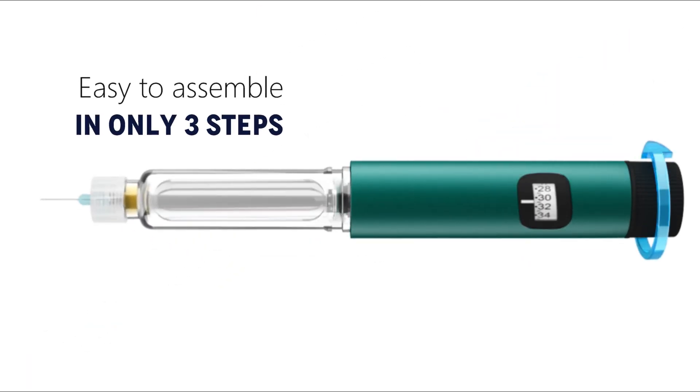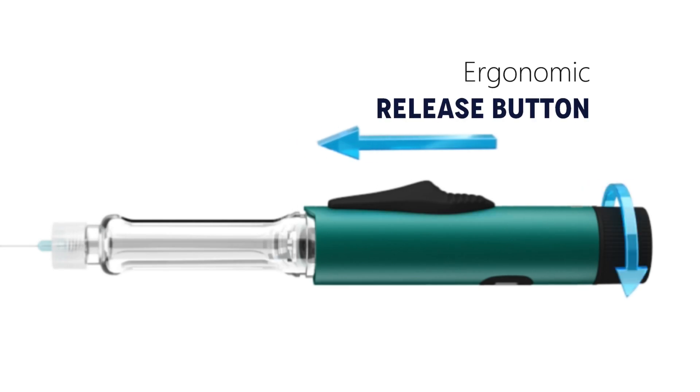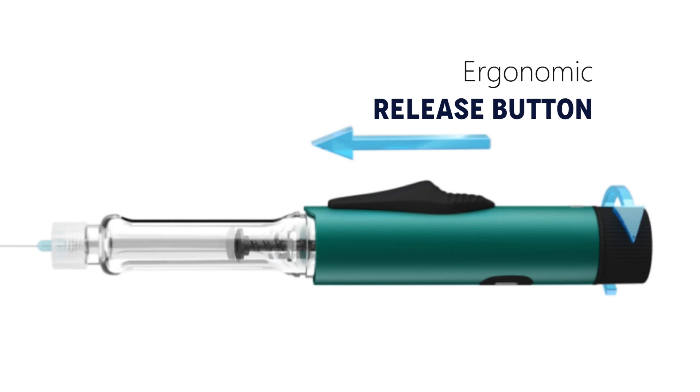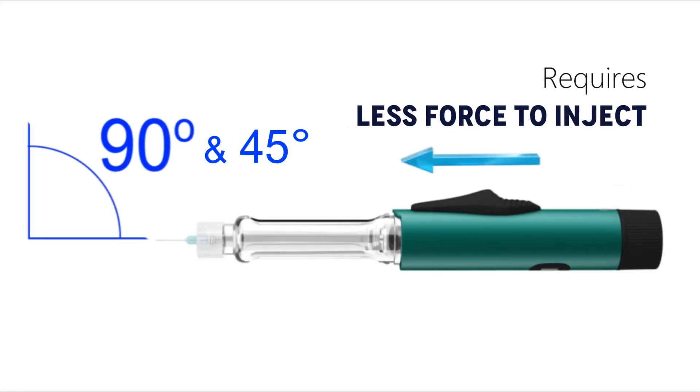It's easy to screw in the plunger. It has an ergonomic release button for easy use. Use of Bexumco's Gensoup Antu requires less force than traditional pens.